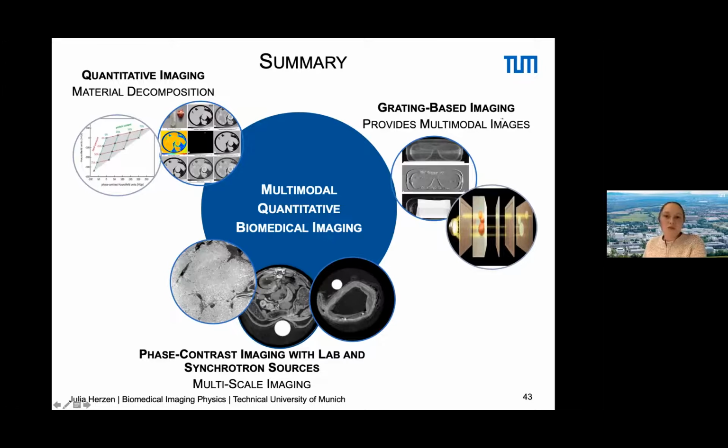We looked at the multimodality, especially with the grating-based method, giving you the possibility to measure in the lab, but also at the synchrotrons. I showed you some multi-scale imaging approaches, where we can scan whole animals in our laboratory downstairs, pre-screening at moderate resolution, and then go to higher resolutions at the synchrotron, where we can scan very small objects down to 1.5 or 1.6 micrometers.